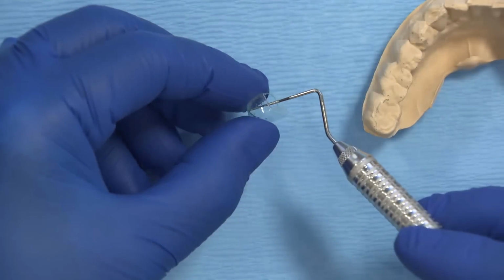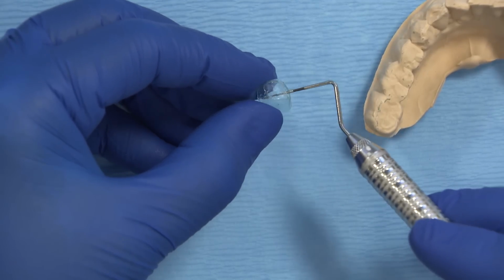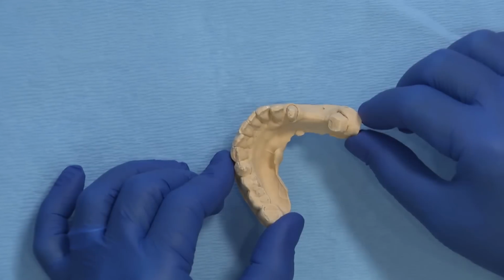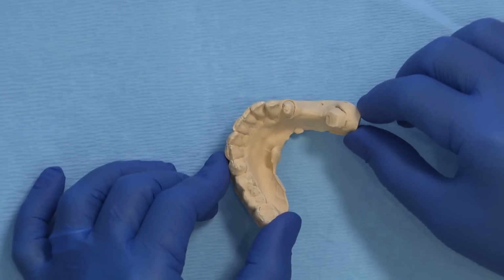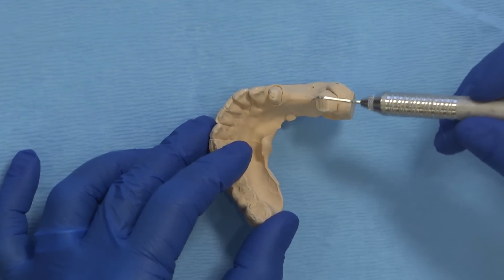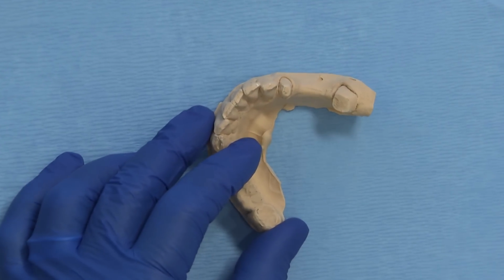Another option is to rely on the lab to send you a reduction coping to adequately reduce the undercut. Out of the two, I prefer the first one. When holding this model, there are many different ways to view and to look at. I remember as a technician, I was very quick to point out the draw problem looking at the model.